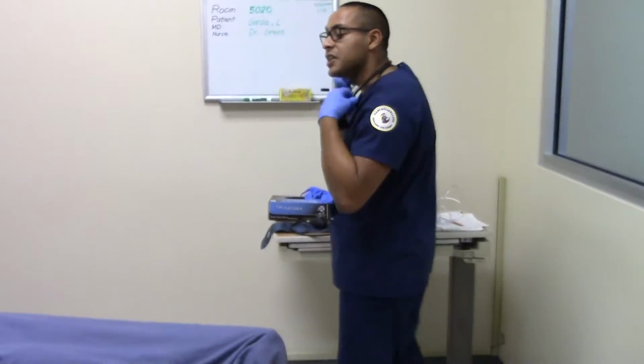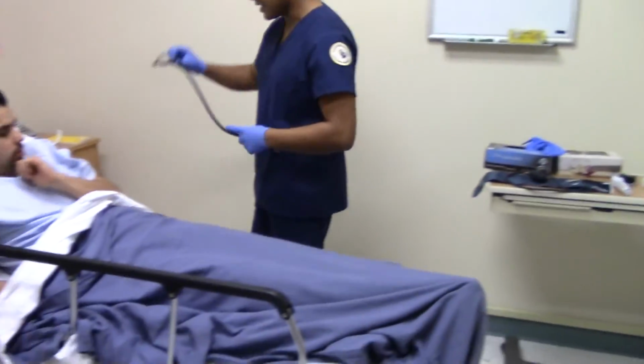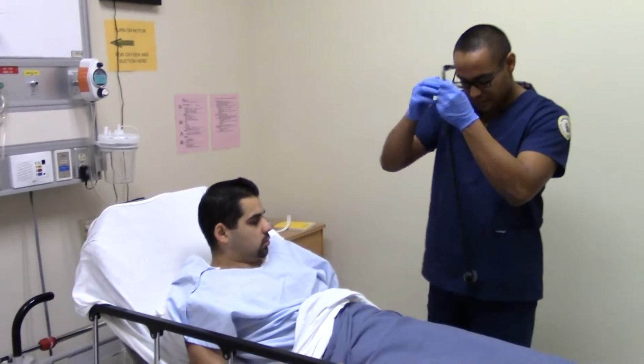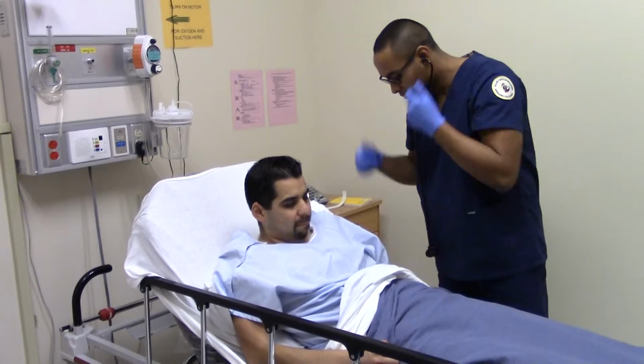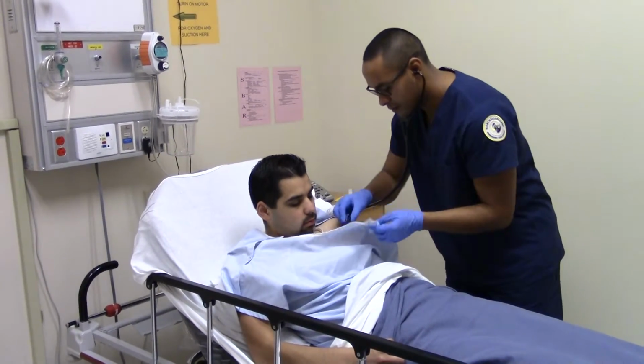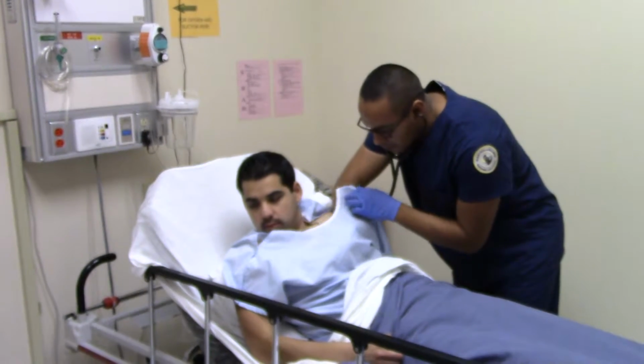All right, I'm going to go ahead and check lung sounds, okay? Let me see the wheezing out of the way. Same thing, okay? Breathe in.